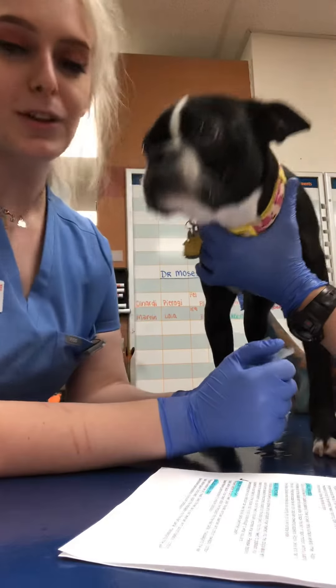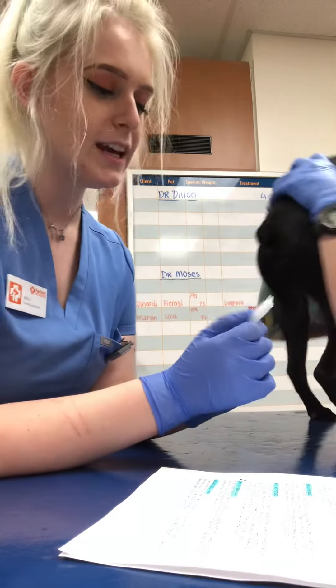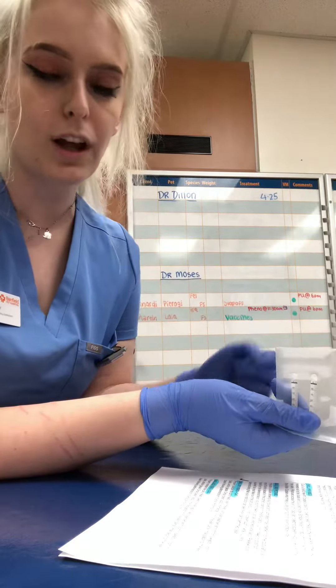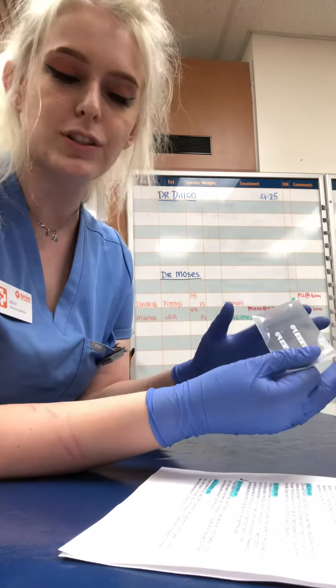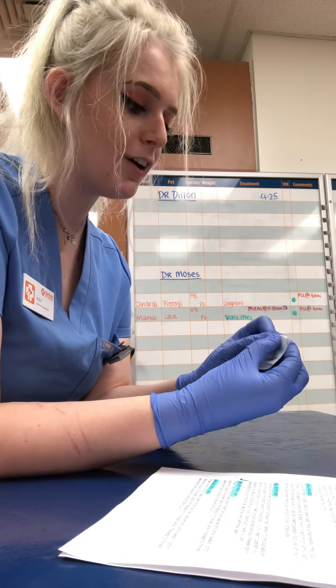We're going to be doing the Schirmer Tear Test. In order to do this, we'll be using the Schirmer Tear Test strips. It is important that you do this step prior to any ophthalmic medication or flush on the eyeball, as that can alter the results. First, we will be bending the strips at the notched area.